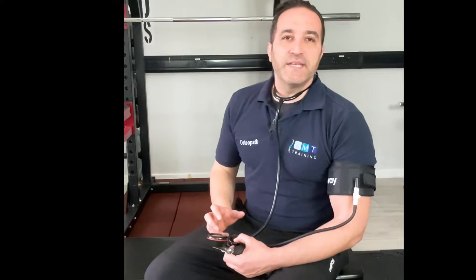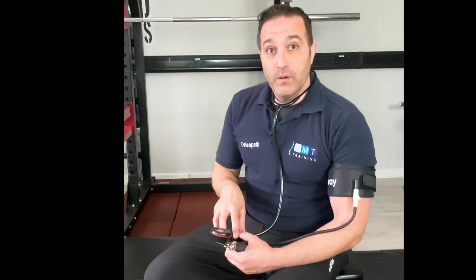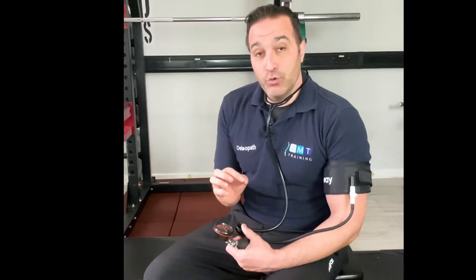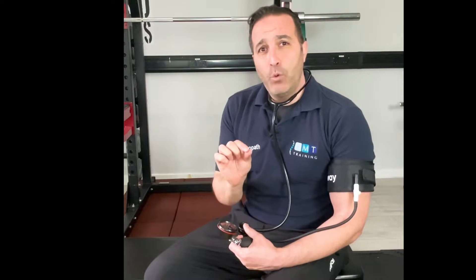In this video, we'll be discussing how to achieve limb occlusion pressure or LOP using the air cuff. This is more applicable overall in a more clinical rehabilitation type scenario. It enables you to be a little bit more accurate in what limb occlusion pressure you are after, and as you move further on in the rehabilitation phase, you can adjust it to be more specific to that patient at that time.